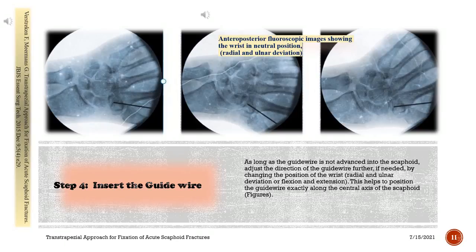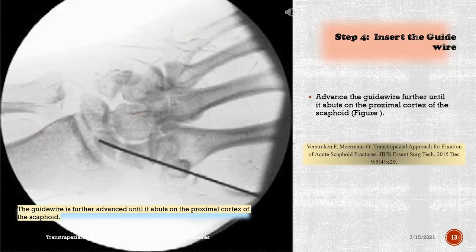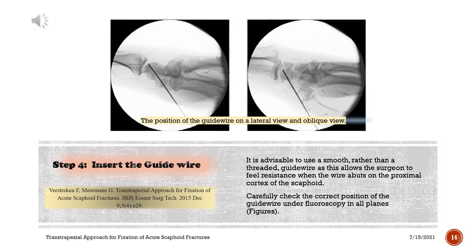Confirm guide wire position on antero-posterior fluoroscopic images showing the wrist in neutral position, radial and ulnar deviation, and on lateral fluoroscopic images showing flexion and extension. Advance the guide wire further until it abuts on the proximal cortex of the scaphoid. It is advisable to use a smooth rather than a threaded guide wire, as this allows the surgeon to feel resistance when the wire abuts on the proximal cortex. Carefully check the correct position of the guide wire under fluoroscopy in all planes, including the lateral view and the ulnar deviation view.